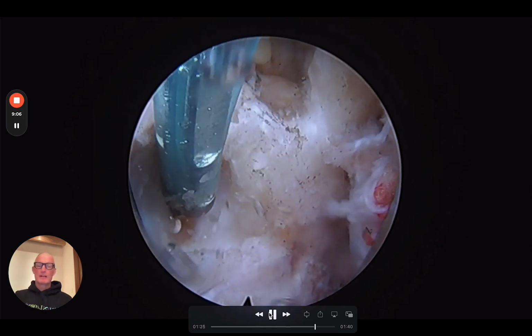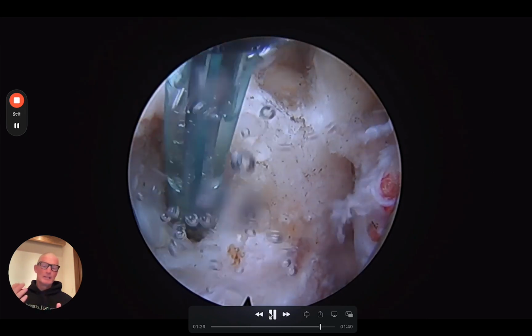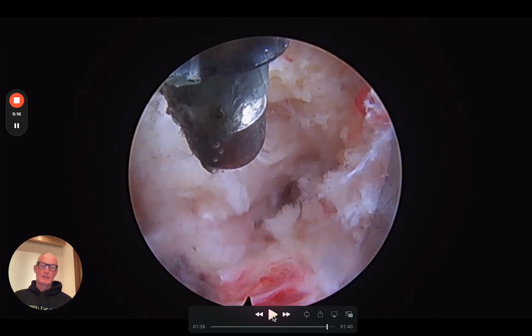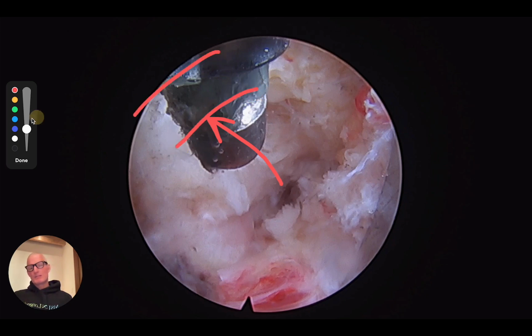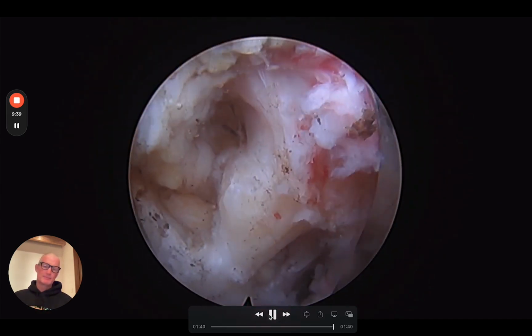And here I'm just cleaning up the final little bits of soft tissue in order to complete that picture. Let's pause right there. So there's the surgical field, where we see the curve of the superior articular process becoming the transverse process, and the previous course of the medial branch going underneath the mammillo-accessory ligament. And that area has now been cleaned down to the periosteum.